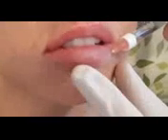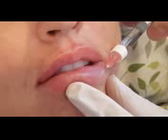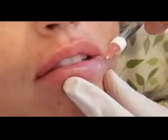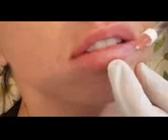See how it will track across. I feel the product over here. It's only a half-inch needle. So I went in here, that's where the needle stops. The product's over here, ready to track right across.